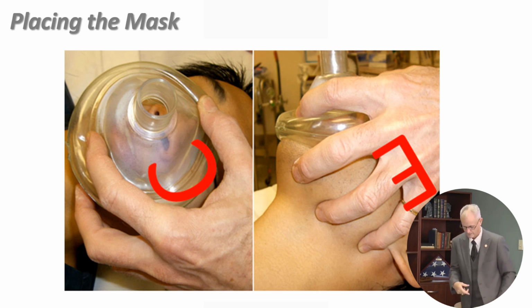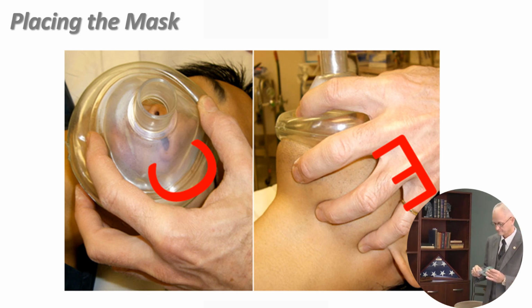So that's what happens. Now, here's the other thing that happens when they lay around in there. They flatten out. So be prepared, if you're going to pull it out, to be able also to blow it up. It takes a little bit of air to fill that thing up too. But once you've got it full, then you can get a seal.